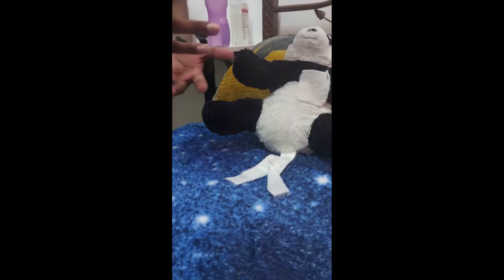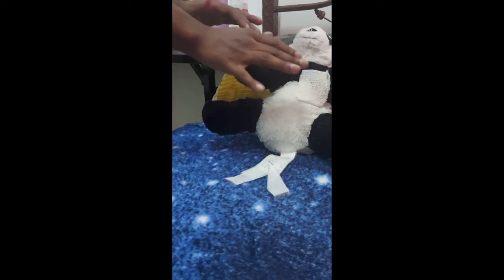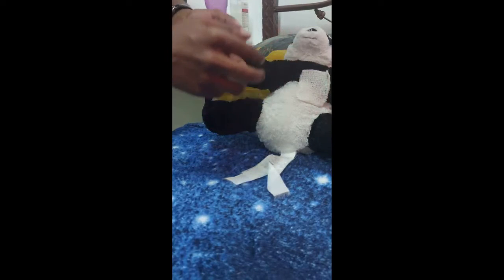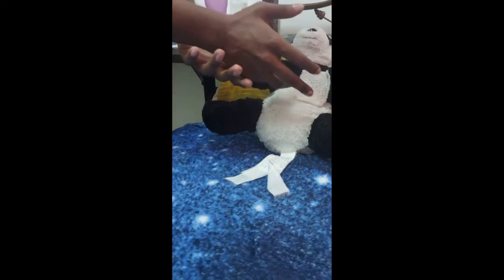The next thing that you will have to do is check the site of the implant. Now, if there is any discoloration or if it turns a little bit too red, it could be a sign of infection. So therefore, you will have to report it.